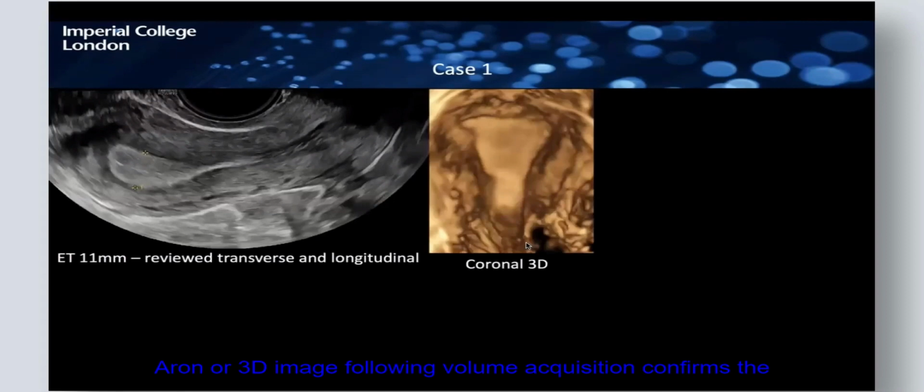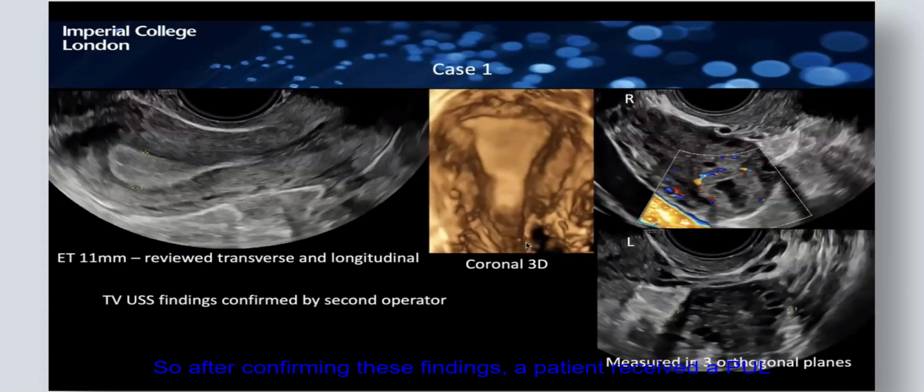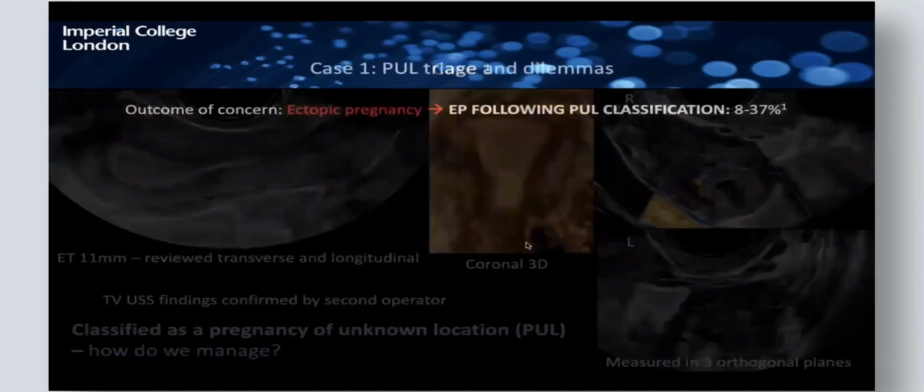A coronal 3D image following volume acquisition confirms the lack of intracavity structures noted on 2-dimensional screening, with systematic review of both adnexa only confirming the presence of a right ovarian corpus luteum. So after confirming these findings, our patient received a PUL, or pregnancy of unknown location classification.